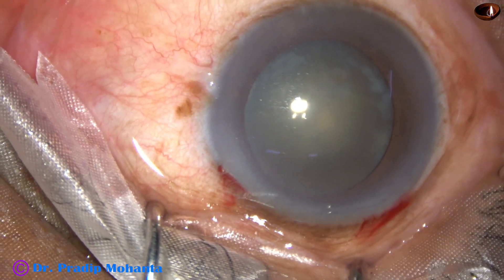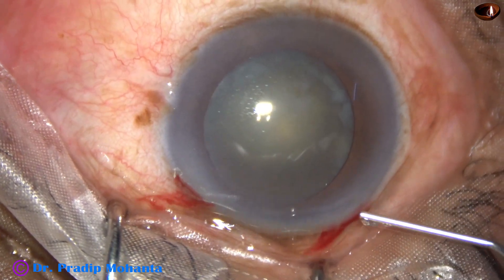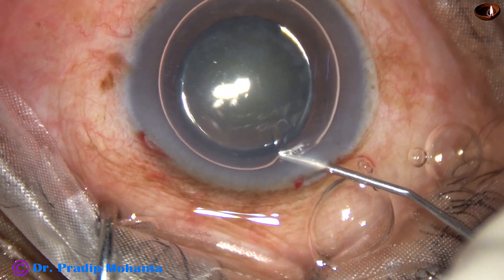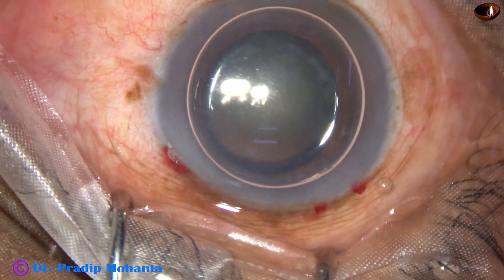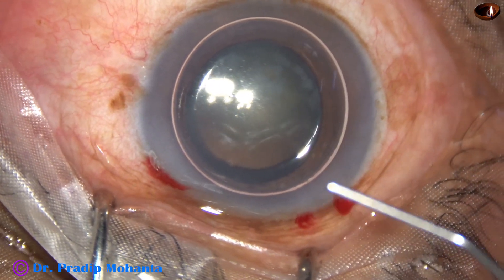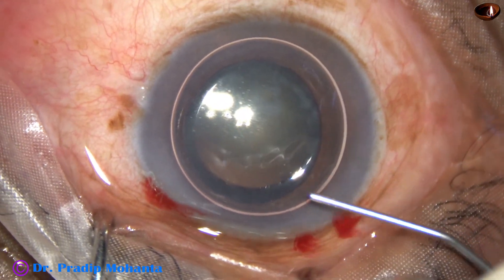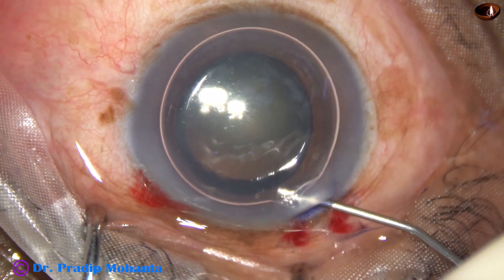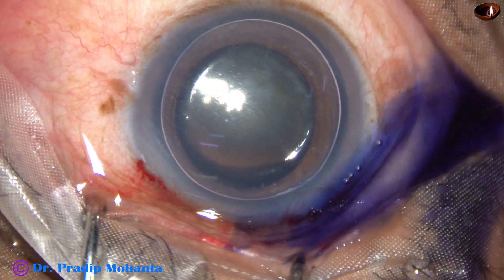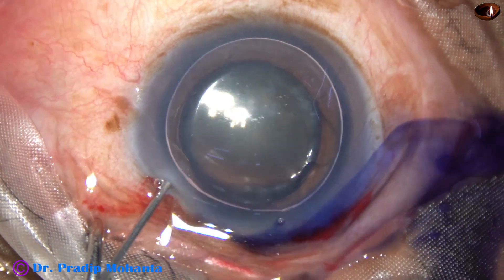An air bubble is injected into the anterior chamber, and beneath this air bubble, trypan blue dye is applied over the anterior capsule. When we apply trypan blue dye underneath an air bubble, staining is very quick — we do not have to wait more than 15 seconds before washing out the dye.